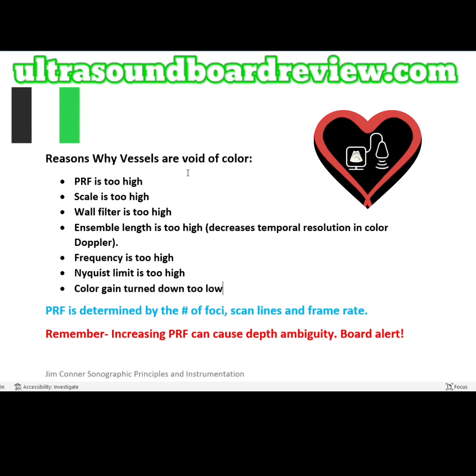Here's all the reasons why vessels are void of color. The first is your PRF is too high, scale is too high, wall filter is too high, ensemble length is too high. This decreases your temporal resolution in color Doppler, by the way. Frequency is too high, Nyquist limit is too high, and also your color gain is turned down too low.